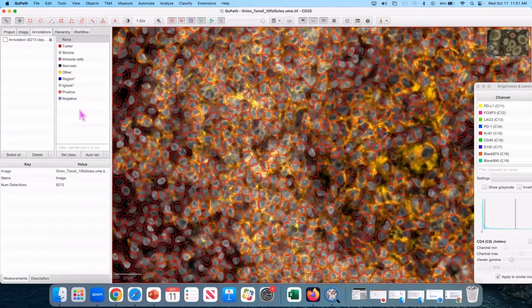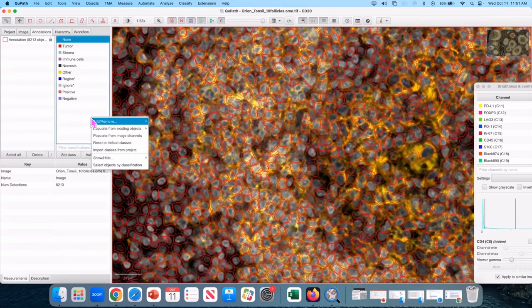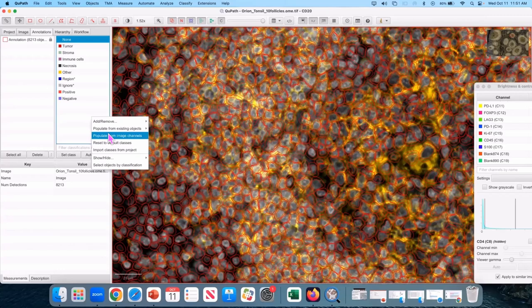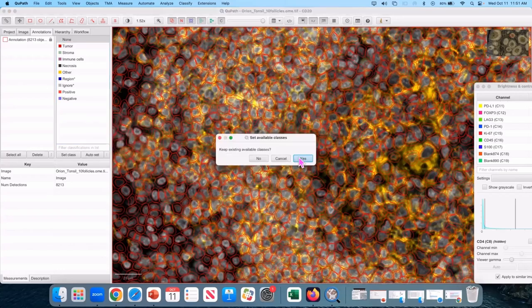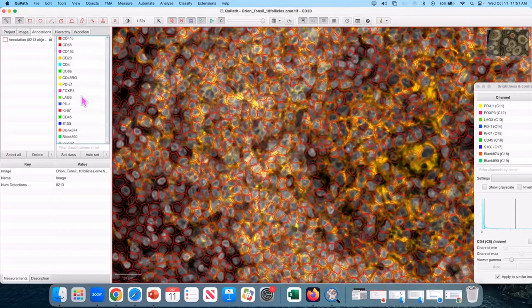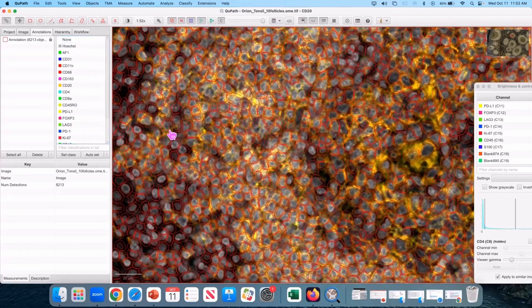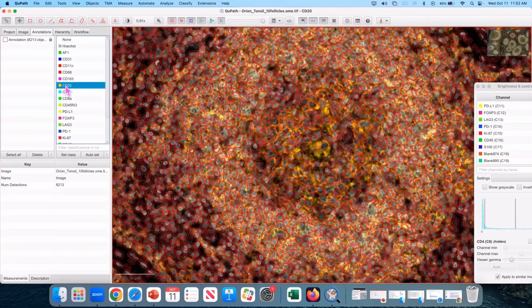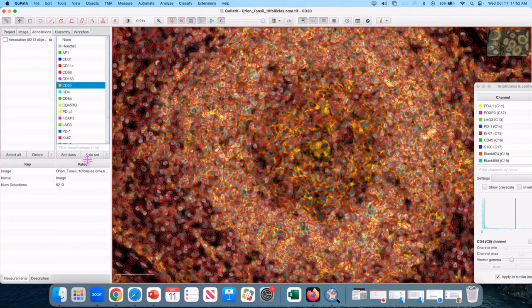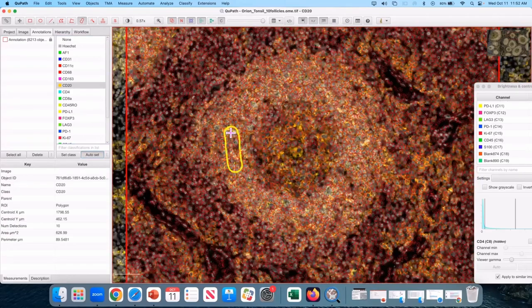Oh, one other fun trick is go to the annotations, go to the class list, right click, populate from image channels. And I'm going to not keep my existing classes. And now you have preset all of the classes that you're going to need to make your multiplex classifier. So then I can click CD20, click auto set, click my brush tool and have at it.